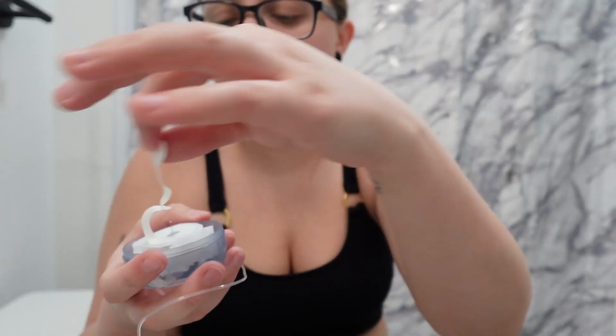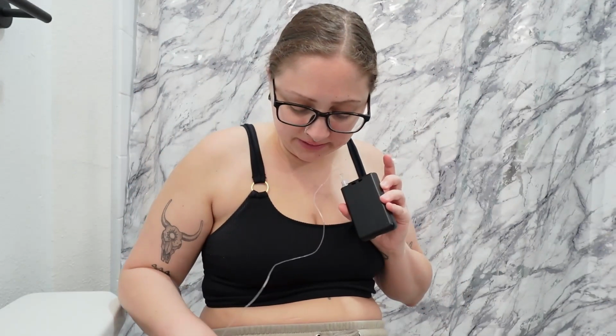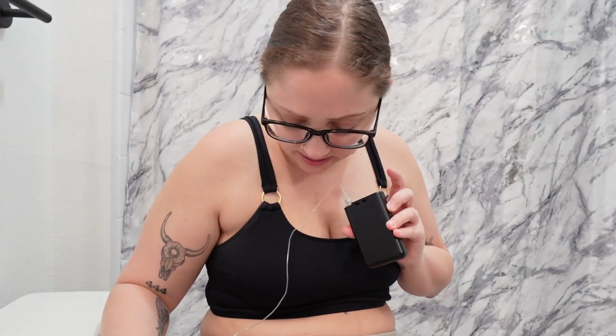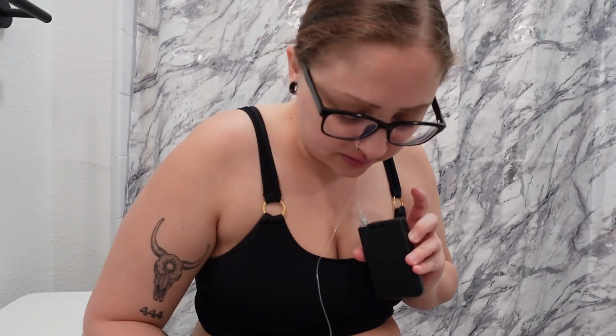I took off the little cap, and then I'm just gonna go ahead and take off the tape. You have to do it in such a way that you don't offset the site from the ejector, I guess we can call it. So I'm gonna go ahead and take everything, place it exactly where I want it on my thigh. I think I'm gonna do more inner this time because I've done outer a couple times, so let's try this. I'm hoping it's not a muscle. Let's pray together.